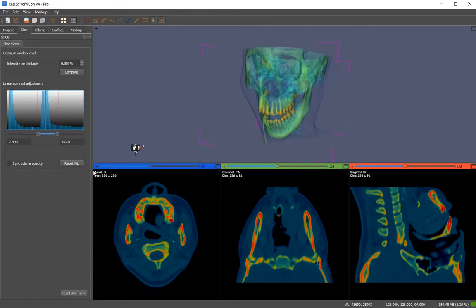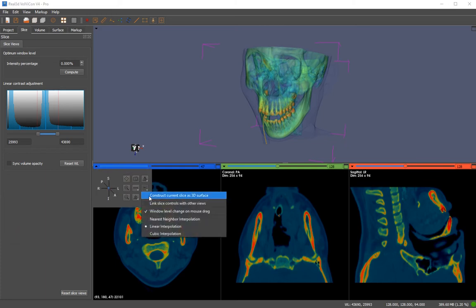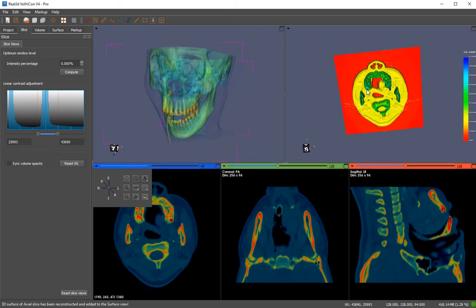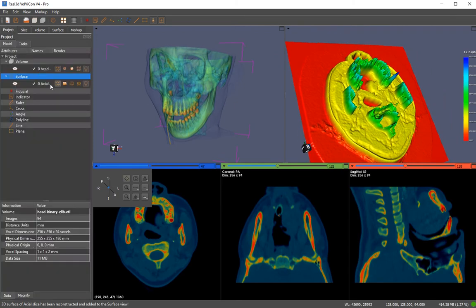Let's go to the slice features. You have flipping options and various options to construct a slice as a 3D surface — you can construct a triangular mesh surface out of the current slice that you can see. Let me create it. You can see this is a surface model.